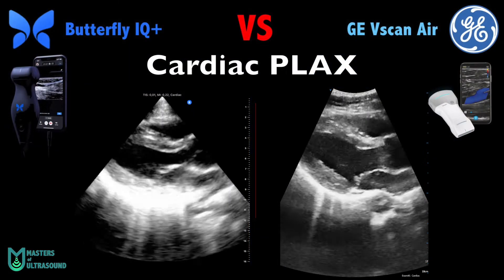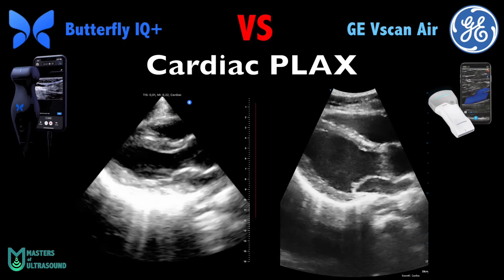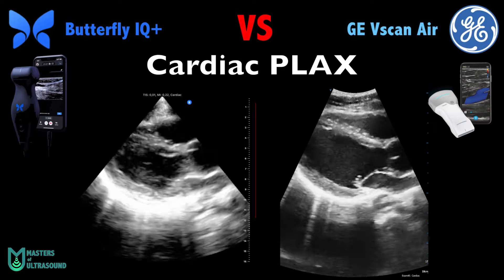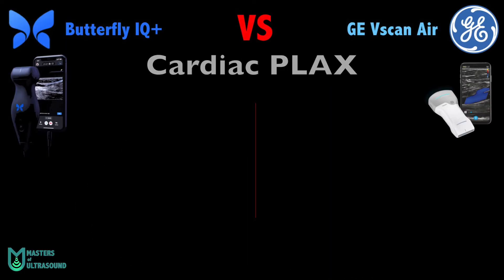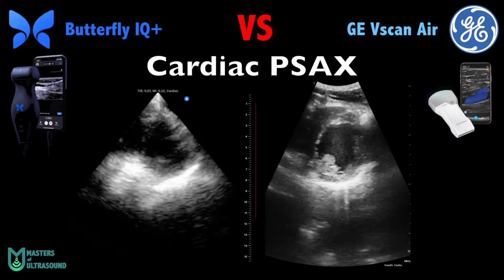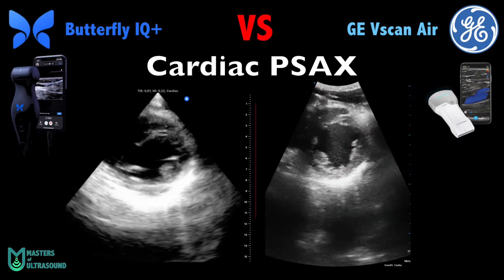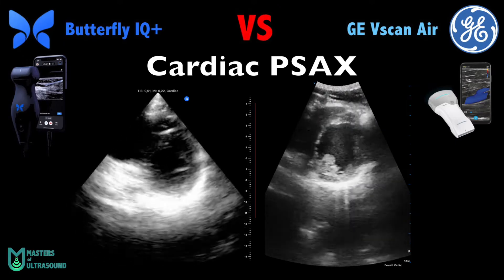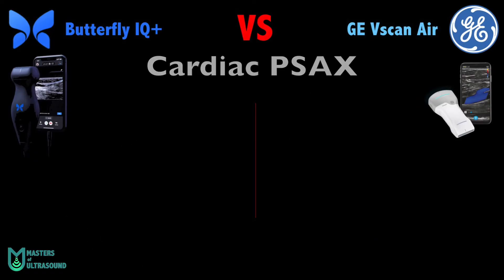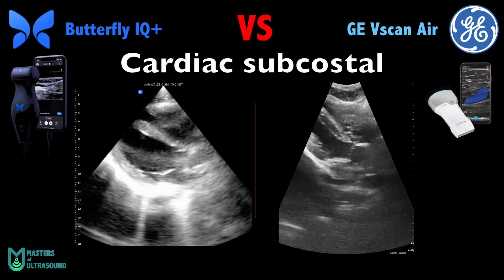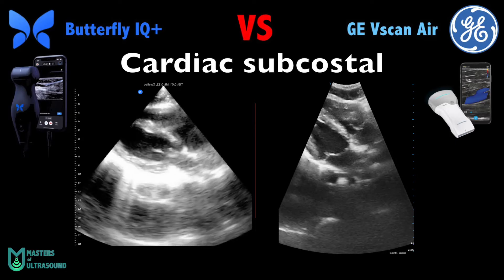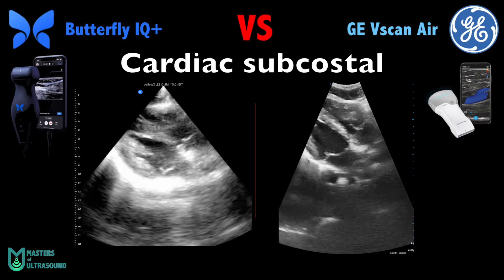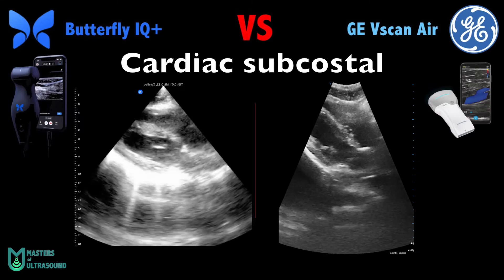Here you can see the cardiac parasternal long axis. As you can see, the B-mode is one of the strong points of the Vscan. Here is the parasternal short axis, and you can see the image has more definition on the Vscan side than the Butterfly IQ side. Here is the subcostal view — the pericardial definition and endocardial borders are better on the Vscan.